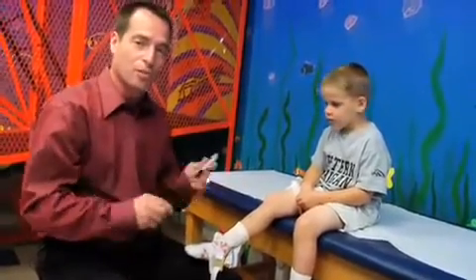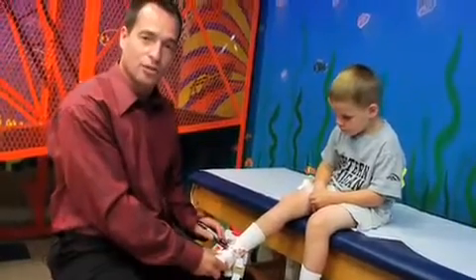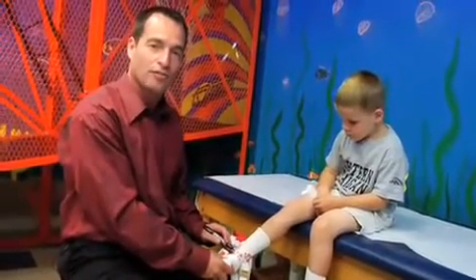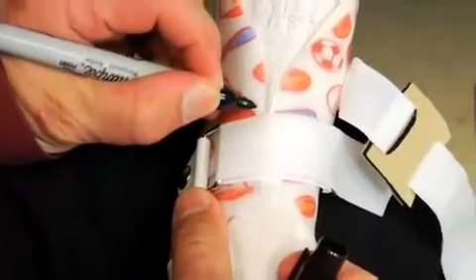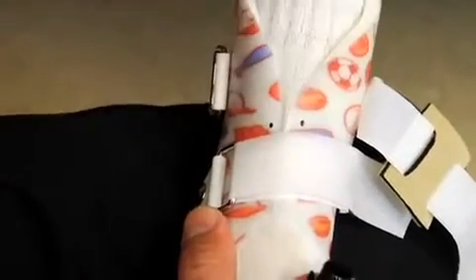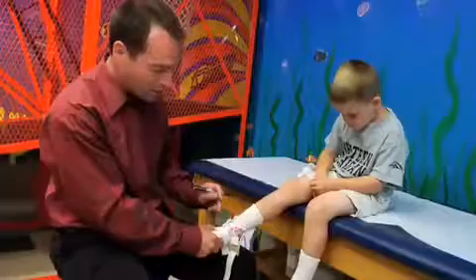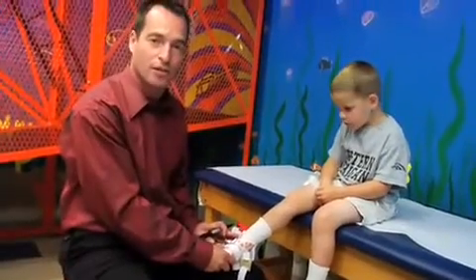The next step is to mark your dorsum wings to make sure they are not too close together. When we get to within an eighth or a quarter of an inch, we often get some pinching. I'd like to normally see about three-eighths of an inch between the dorsum wings on smaller children, up to about a half inch on larger children. By putting a couple of marks on there, you'll know where to trim them.